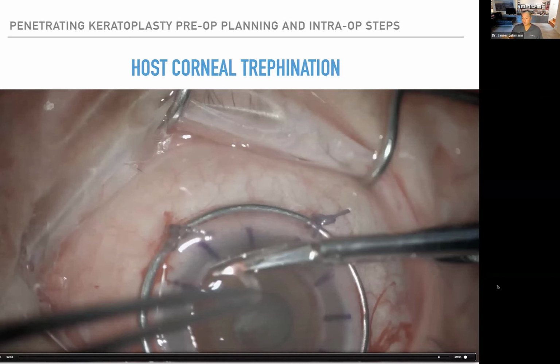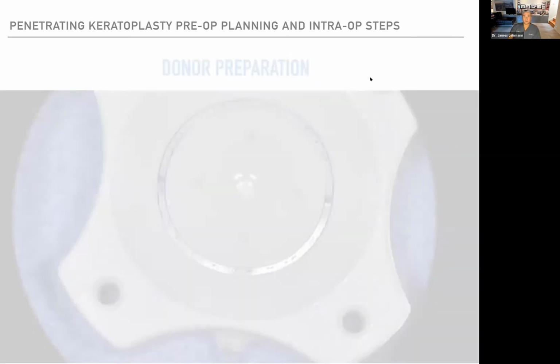That creates room, and it stays put during the trephination. I wouldn't try to suture it or anything like that. So just deepen the chamber with a dispersive viscoelastic, and you can still do the vacuum trephine.